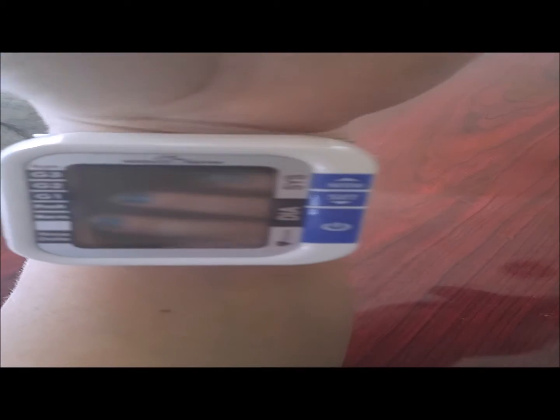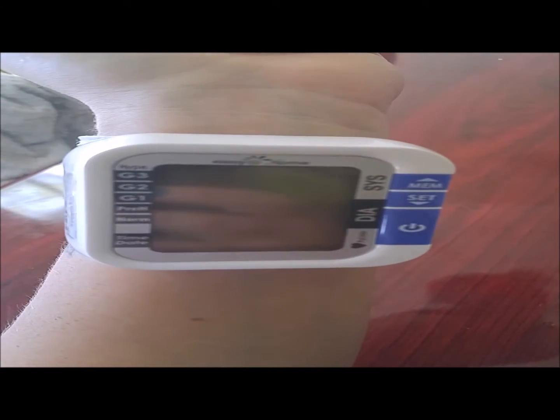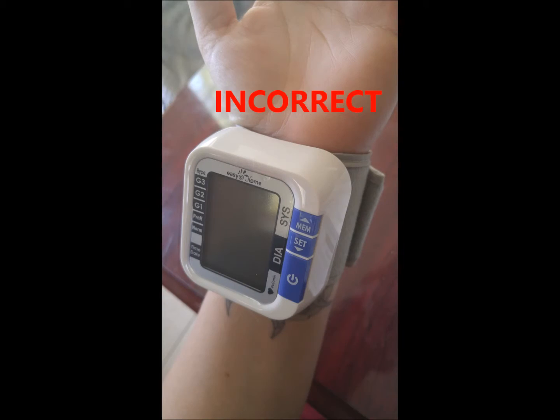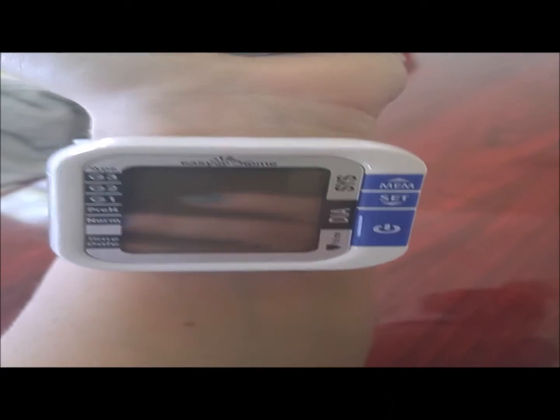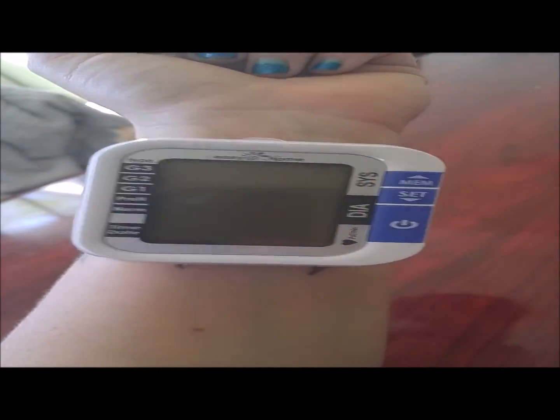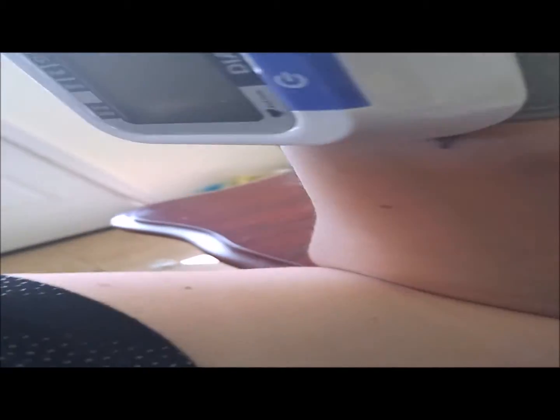Now it is time to use our cuff. To position it, make sure that it is not directly on your wrist joint — this is the incorrect way to wear it. We want it positioned so your wrist is fully functioning and can move. Then you're going to have your elbow slightly bent so the monitor is level with your heart. You don't want to over-bend your elbow, just a slight bend.